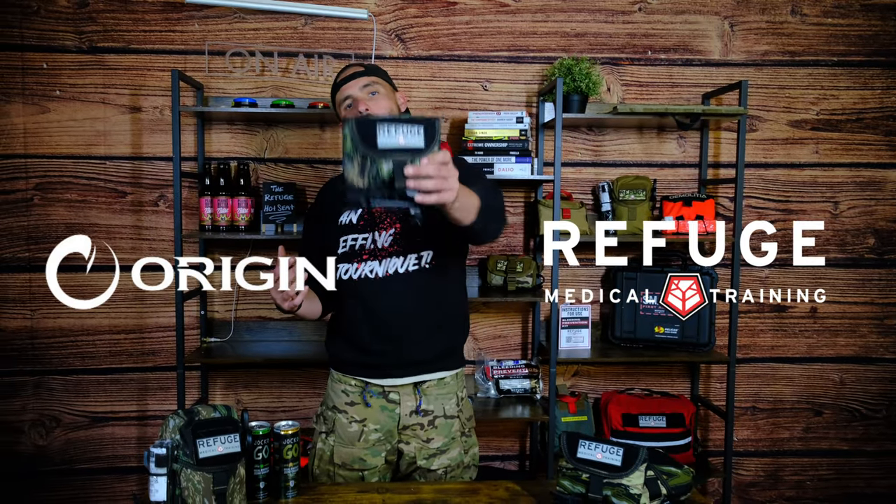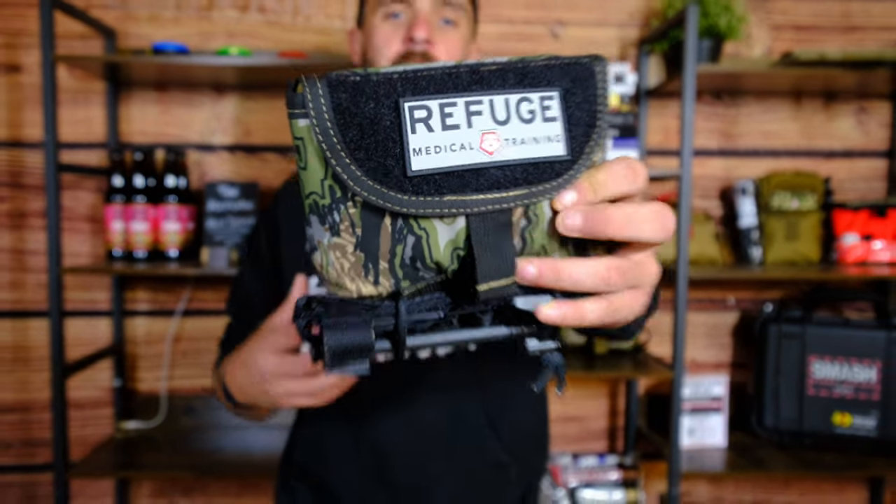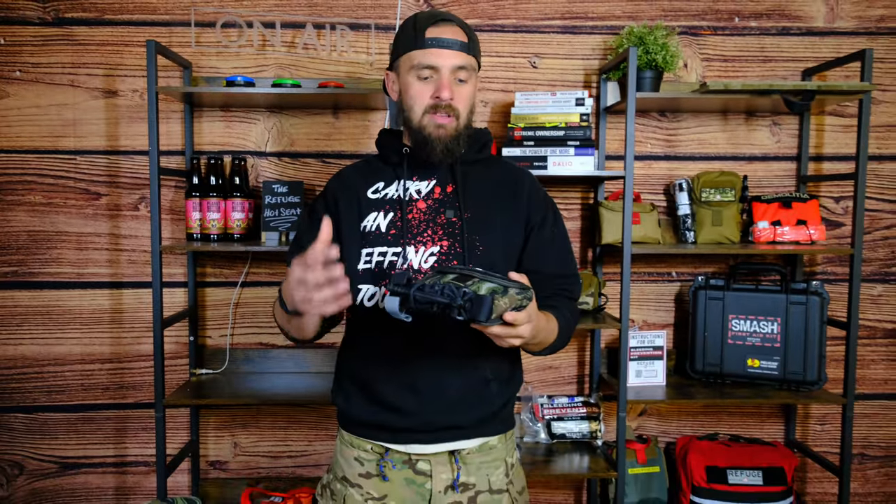What's up guys? Today we're going to be talking about the Origin Refuge Whitetail IFAC, a small purpose-built IFAC where the whole design was centered around giving you the awesome opportunity of utilizing the Origin Raptor camo inside of the SOB platform from Refuge.